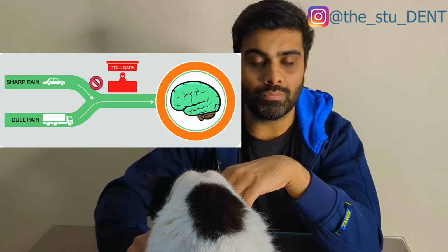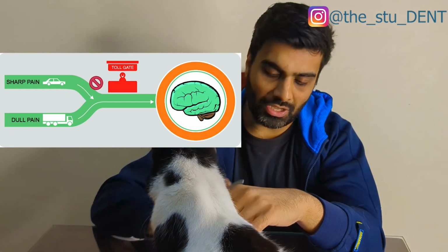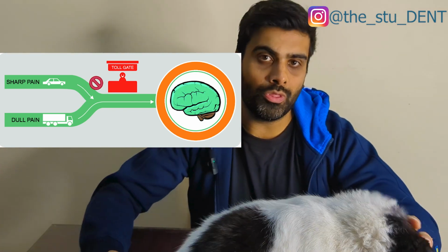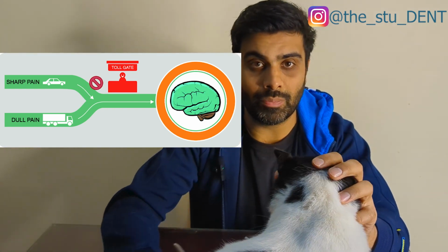You'll feel a burning or a tearing sensation as the liquid goes in and pretty much pulls the skin away from the hard palate itself. So what we use is gate control theory, which is essentially a trick we play on the brain. Pressure is registered more by the body in response to any form of stimulus in comparison to sharp pain. So if, for example, I was injecting you but at the same time pressing somewhere, you would feel the pressure more than the injecting pain itself. Of course, you'd still feel the pain of the injection, but it is a form of distraction.